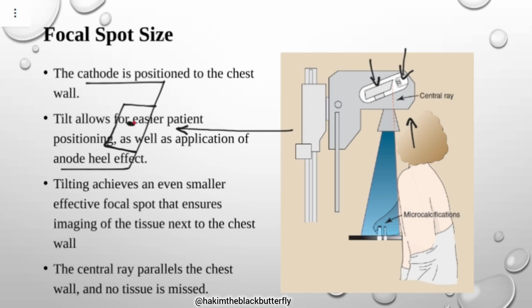These X-rays, as they are coming out of the target, are going to traverse different thicknesses of the target.